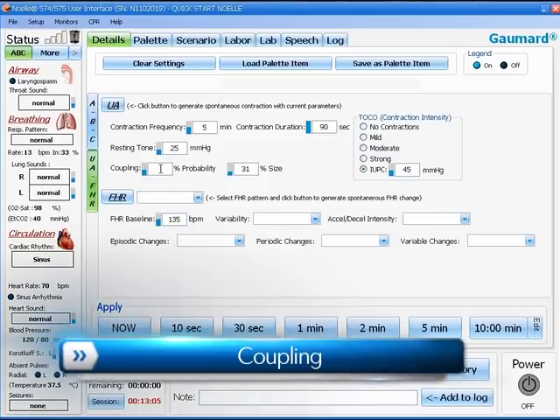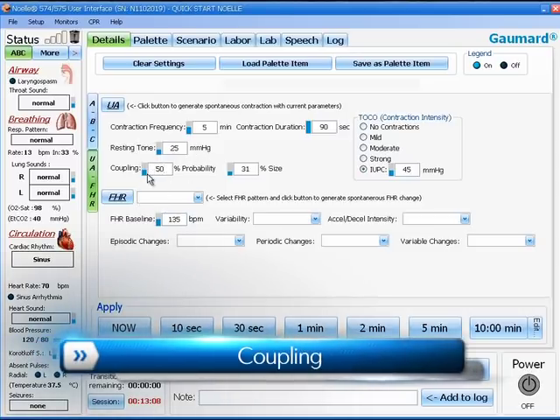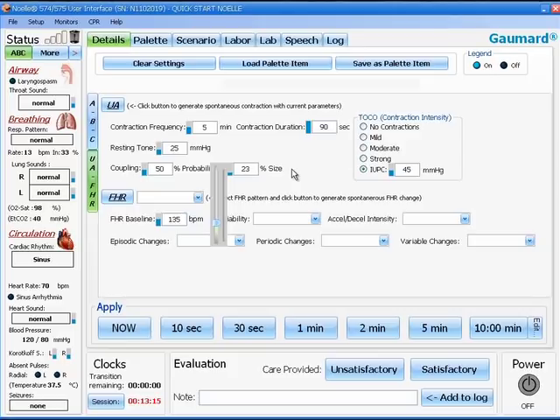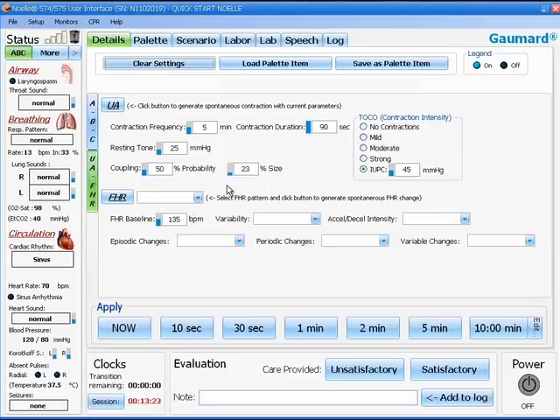Under certain situations, it may be necessary to show a coupling of the contractions. You must set the percentage probability that coupling will occur, and then you must set the percentage size of the original contraction that the coupling will be. If you set zero or leave the box blank, no coupling will occur.